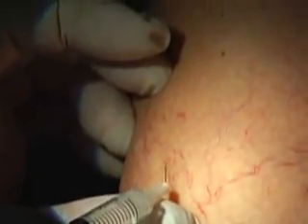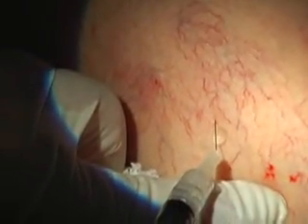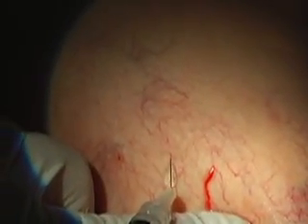That's because the technology has not been there to find and treat the reticular veins or the feeding veins that are causing them. But once those are treated, then we can address the little red spider veins. And with our cross-polarized light technique, we can visualize them very well. And we put a tiny little 30 gauge needle in and inject them with glycerin.